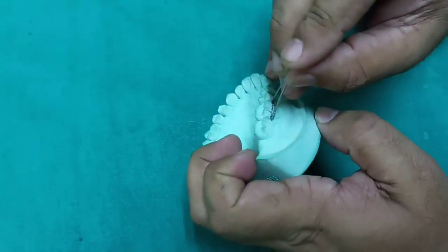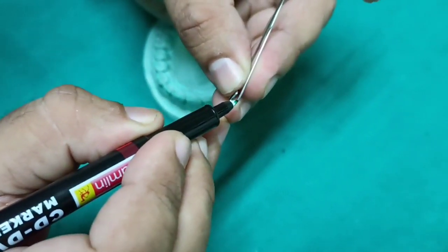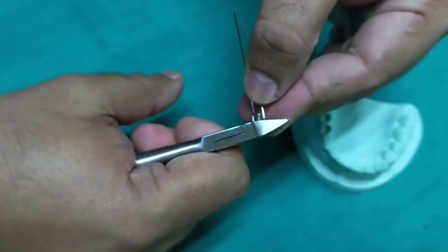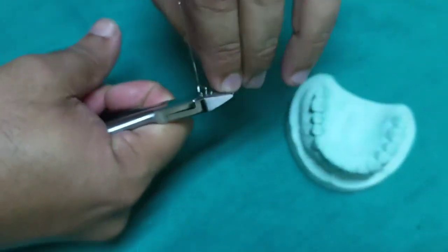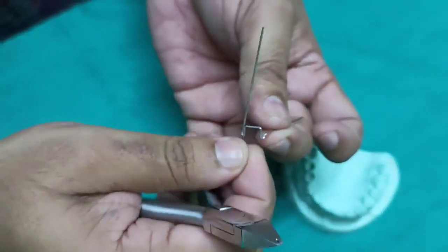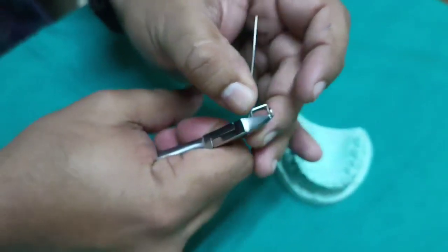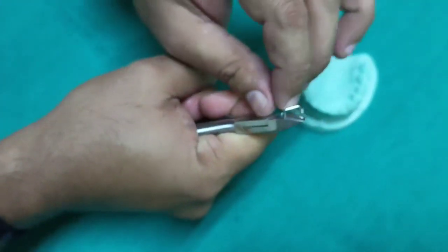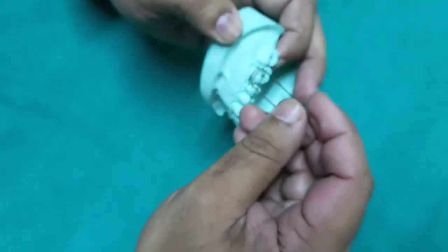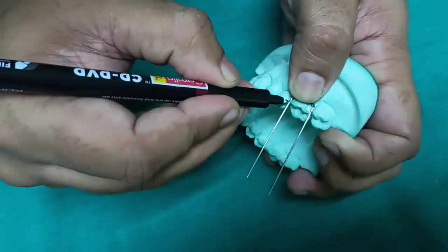Then the third bend. The arrowhead is grasped from the inside of the clasp with half the length of the arrowhead between the beaks of the plier. The tag is then bent firmly upwards using the thumb and the bend continued until the tag is at a little less than 90° to the arrowhead. And this half bend is called the half bend.